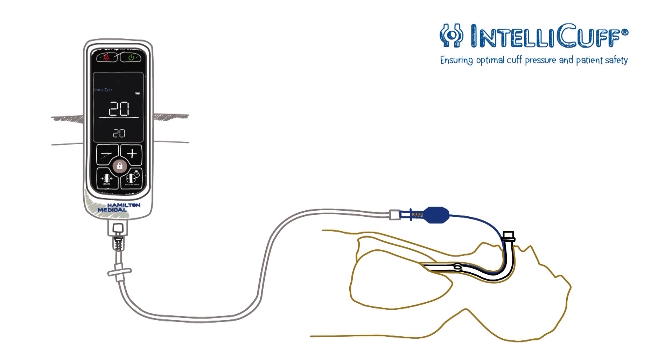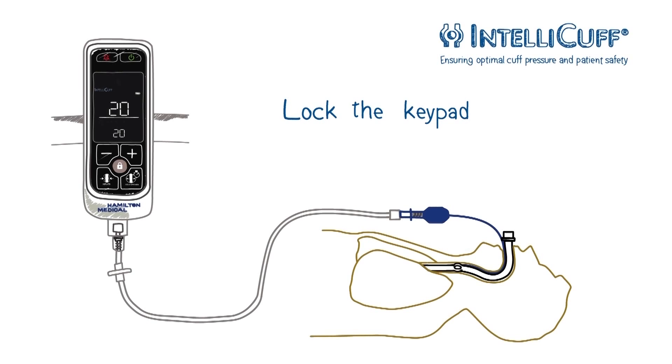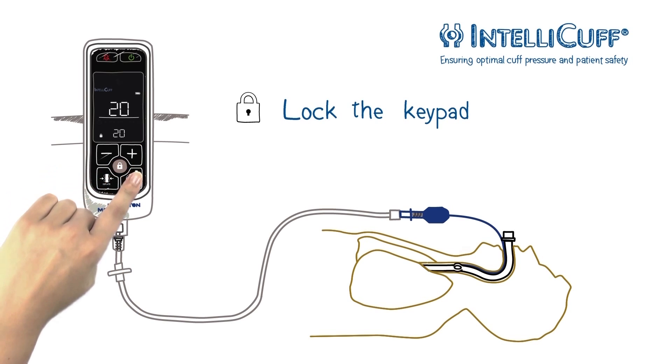Just press the hold button again. For safety purposes, you can lock the entire keypad — just press the lock button. All keys are disabled except for the alarm silence button.